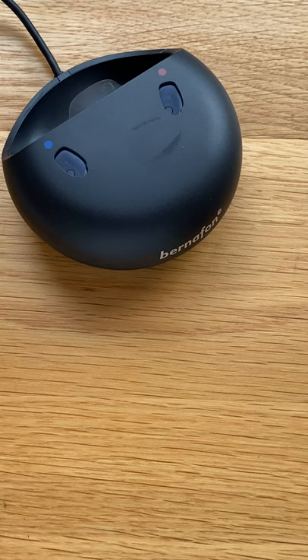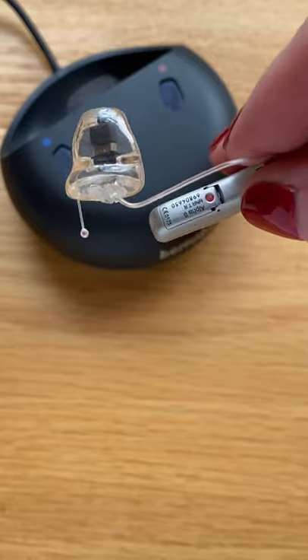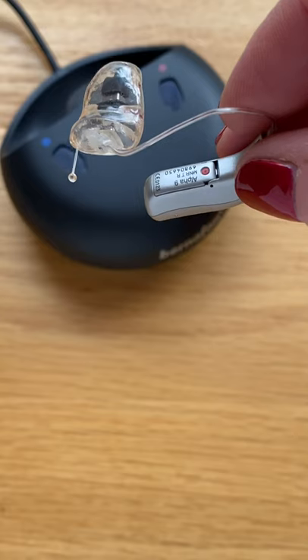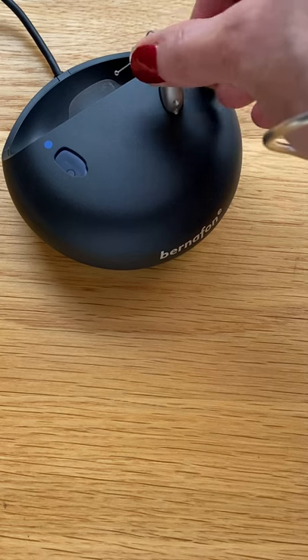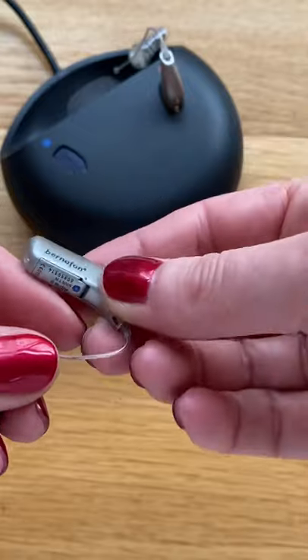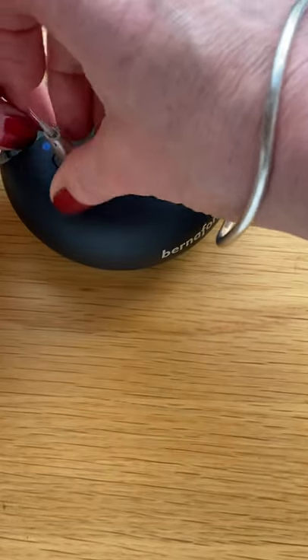We will then get our hearing instruments and put them on charge. We can see that this is the right instrument as it has a red dot on the inside. To dock the right hearing instrument, we go for the red dot. Here is the left instrument and we will charge this like this.